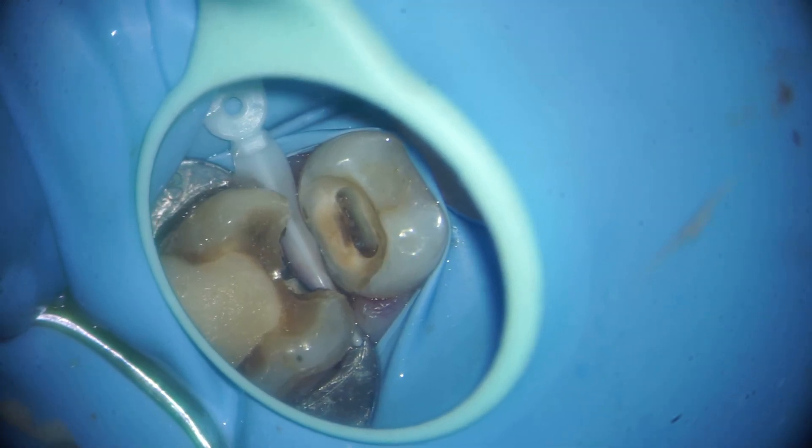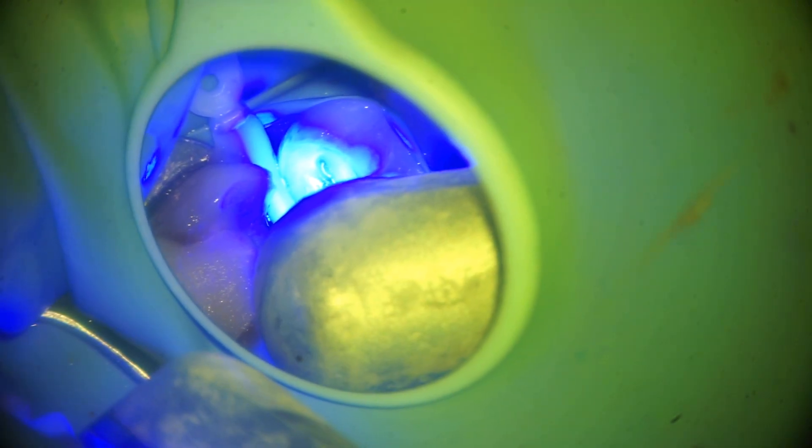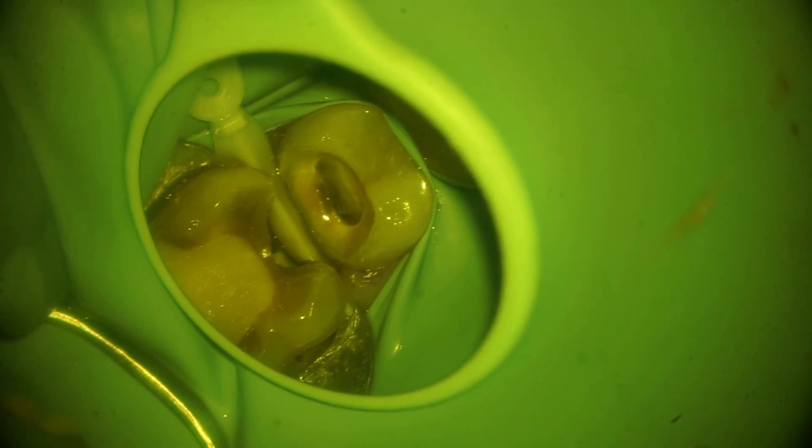After trimming the gums, cleaning, and stopping the bleeding with a hemostatic gel, we have adapted a wedge. You can see this is a wide wedge which has adapted very nicely to the gingival seat. We have etched the tooth and then bonded the tooth.